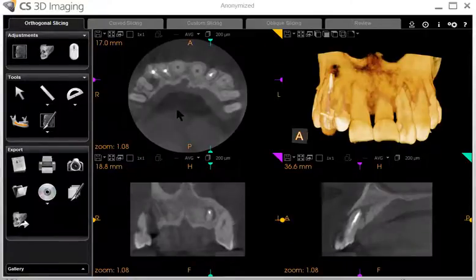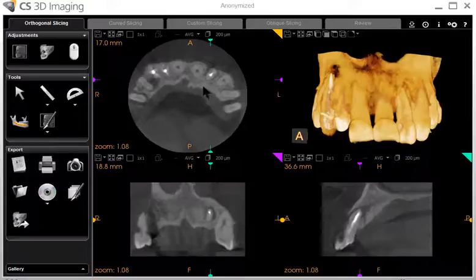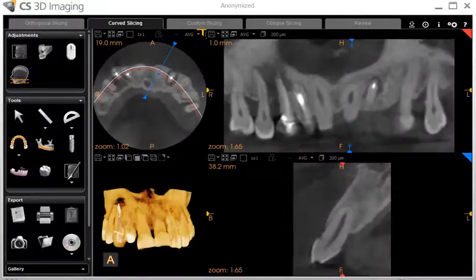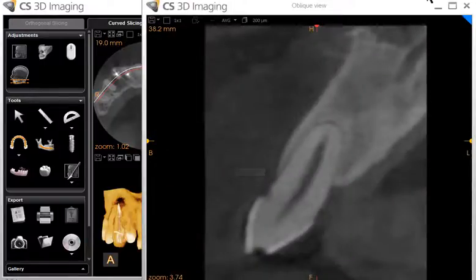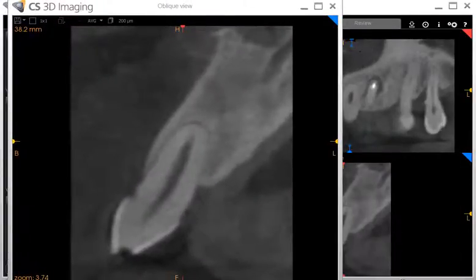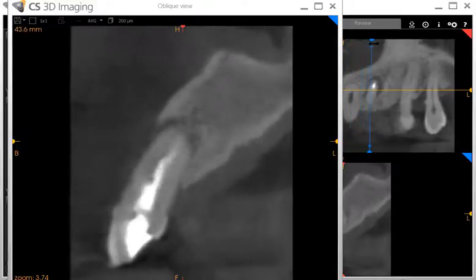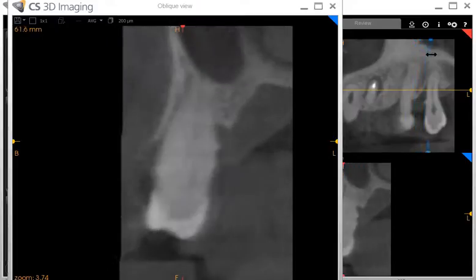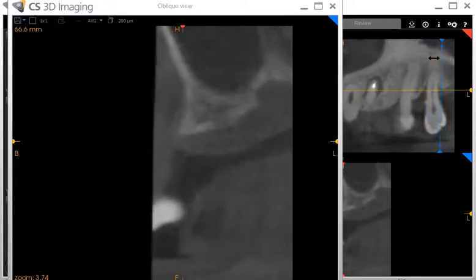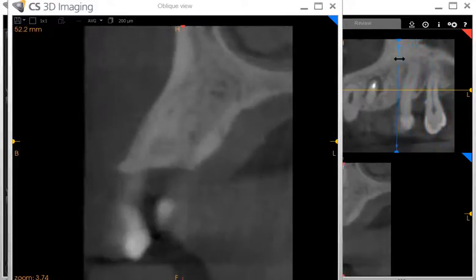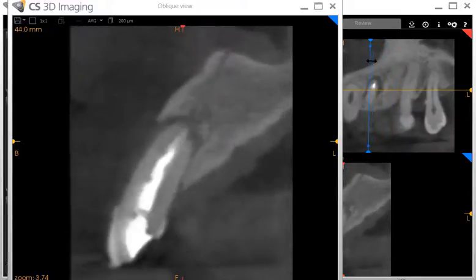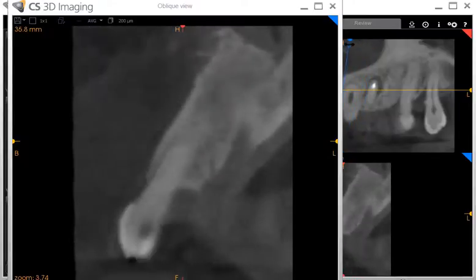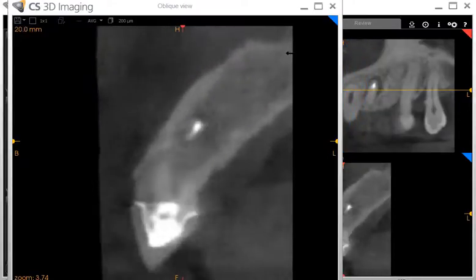We can then go to the curve slice and focus in on each individual tooth to see how much bone loss has occurred, and the level of bone remaining — or that might remain after extractions — if you were considering restoring the teeth with dental implants.